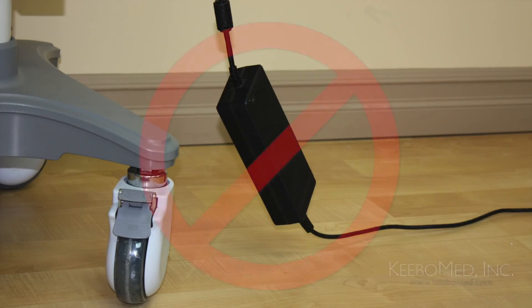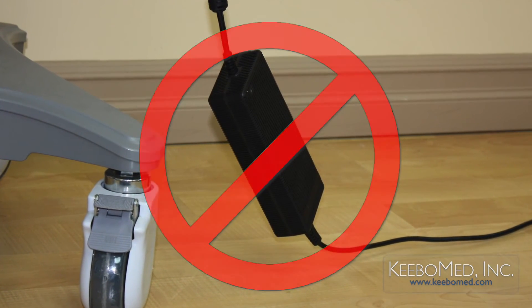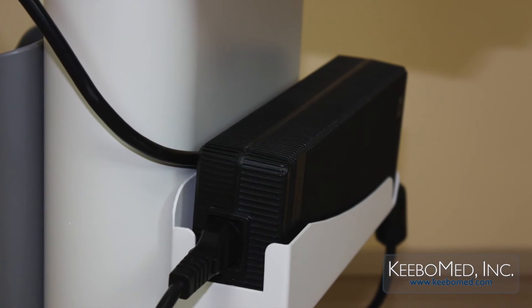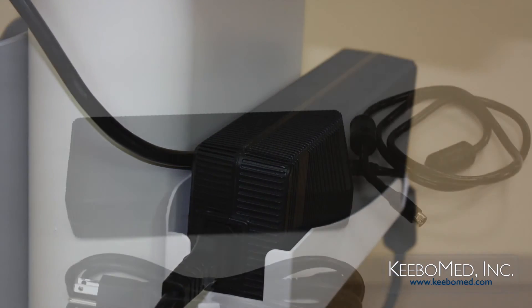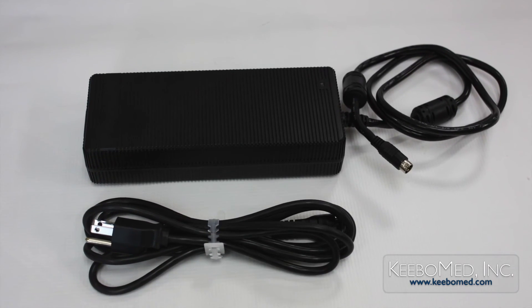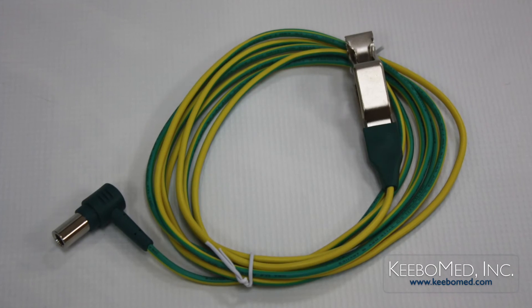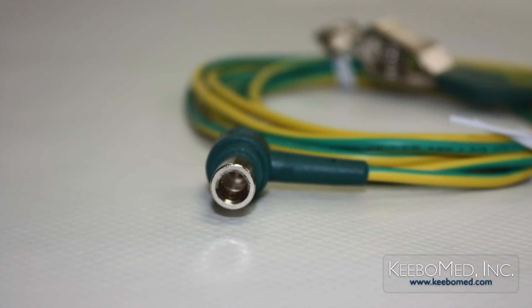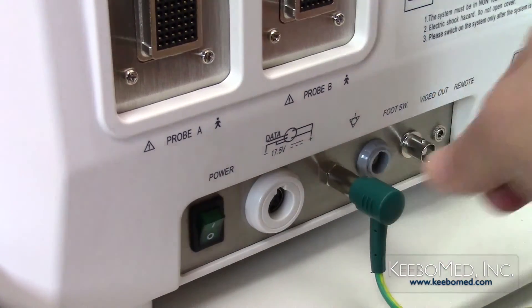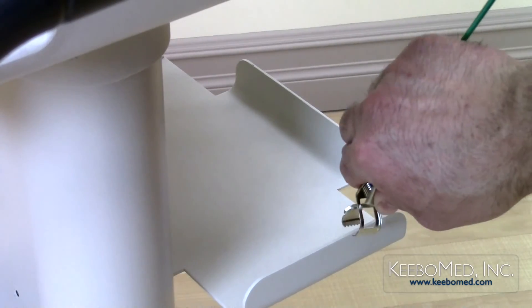Also, do not allow the adapter to hang in the air. Maintain good ventilation for heat dissipation and make sure that the power cable is not tangled. To connect the AC adapter to the ultrasound system, follow these steps. Step 1: Connect the supplied equipotential cable to the grounding terminal on the back of the ultrasound. Connect the other end of the cable to a proper grounding point.